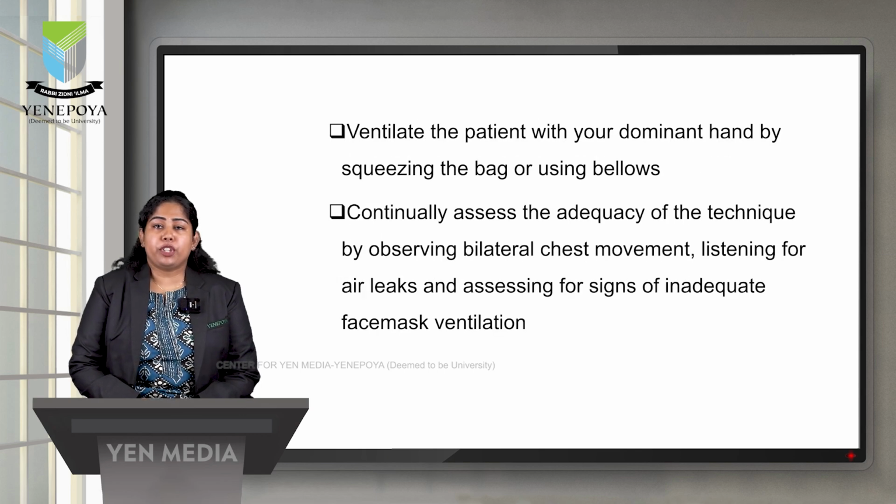Ventilate the patient with your dominant hand by squeezing the bag or by using bellows. Continuously assess the adequacy of the technique by observing bilateral chest movements, listening for air leaks, and assessing for signs of inadequate face mask ventilation.